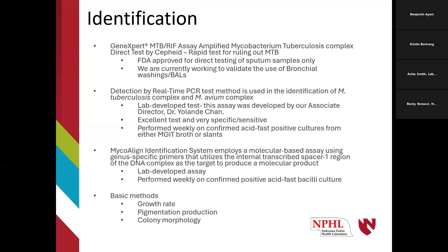Then we have our molecular virology, our molecular micro, take care of the sequence, the primers and the PCR side, and then we send the product over to our molecular diagnostics lab where they have a sequencer.